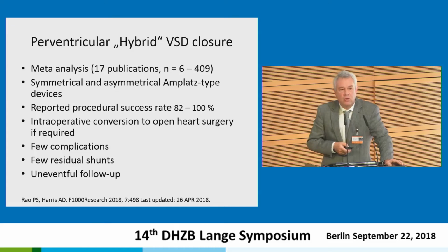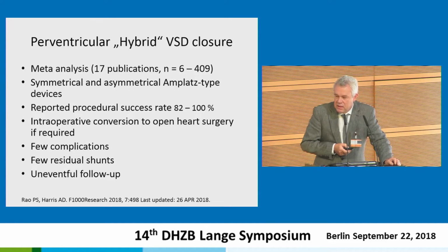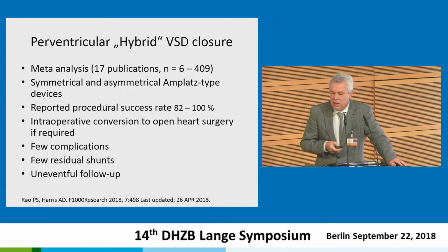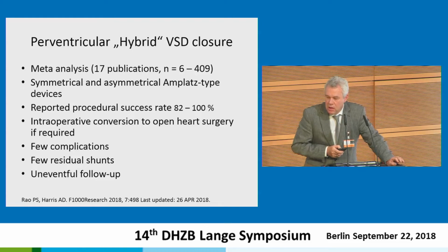And there is no comparative study between this hybrid approach and surgery, and also not between this hybrid approach and the transcatheter approach. There is, however, a meta-analysis with 17 publications, with case numbers from 6 to more than 400 patients per study, and with use of symmetrical and asymmetrical Amplatz-type devices. The reported procedural success rate is between 82%, which is probably very honest, and 100%, which maybe is less so.